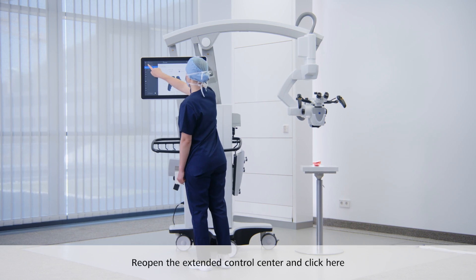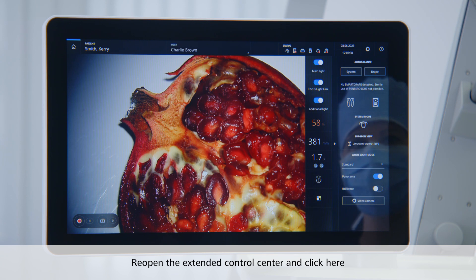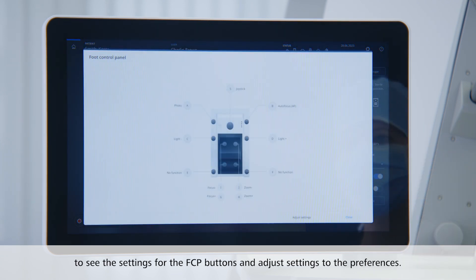If the user prefers to control the device by using the foot control panel, reopen the extended control center and click here to see the settings for the foot control panel buttons and adjust settings to the preferences.